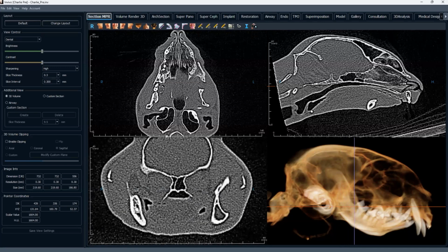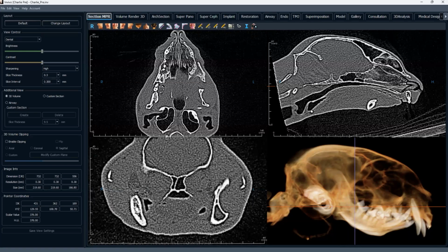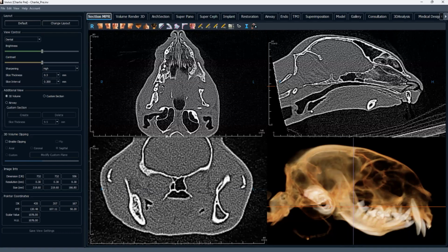And that becomes very germane for when we go to section this. We don't have to worry about dealing with that artery like we would in a normal mandibulectomy. So that actually makes life a little bit easier. If we stay right behind this molar, we can probably approach the entire thing ventrally and buccally and not have to worry about severing that artery or dealing with it when we get the jaw out.